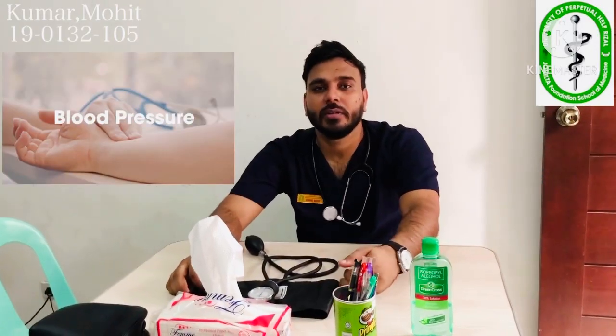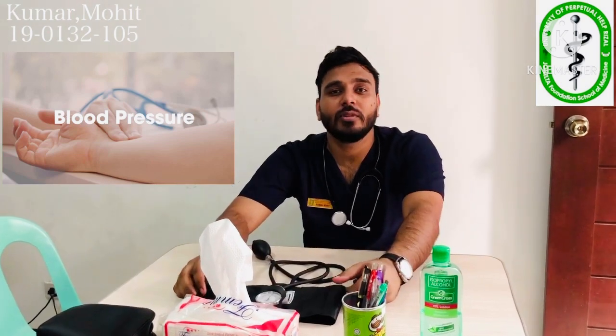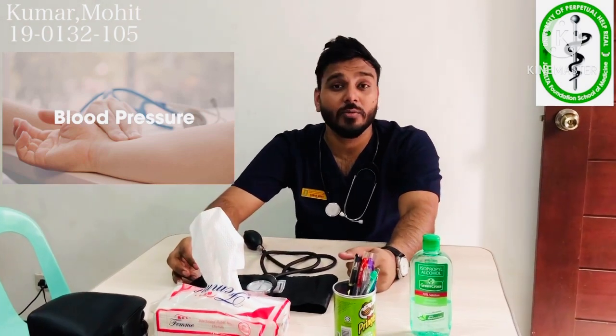Hello everyone, this is Kumar Mohit, a student of medicine here at University of Perpetual Help System DALTA. Today I am going to demonstrate in front of you how to take proper, accurate blood pressure.